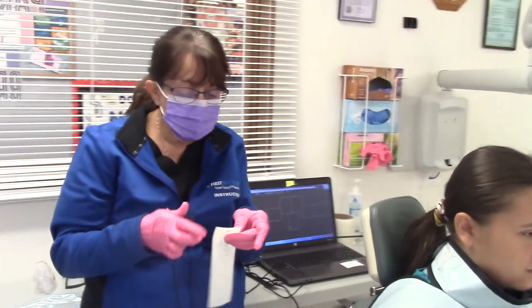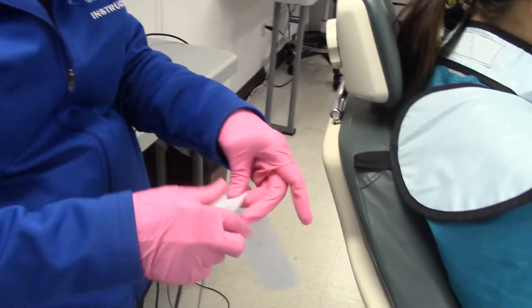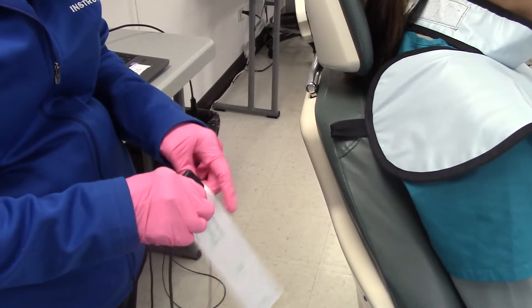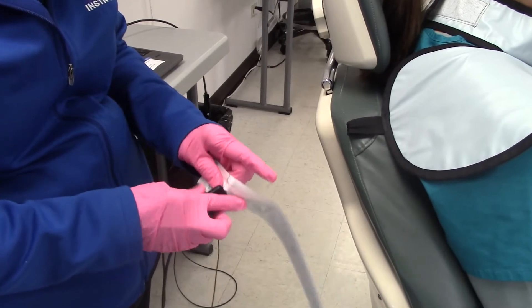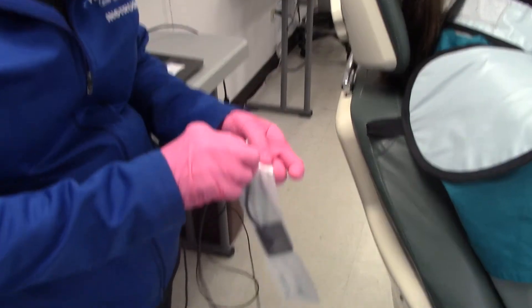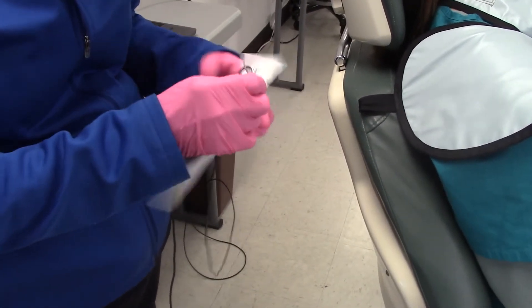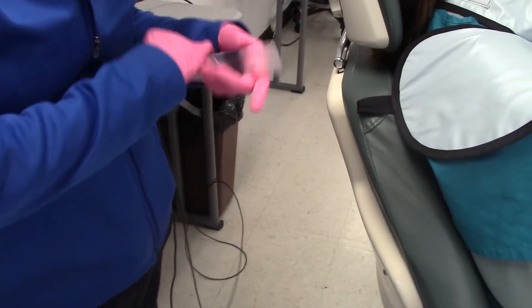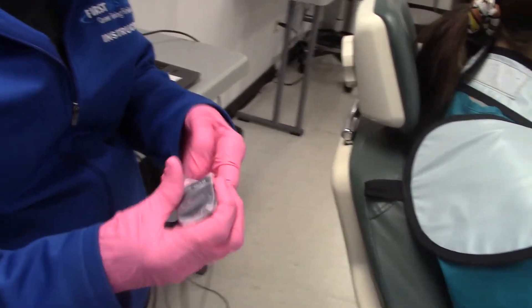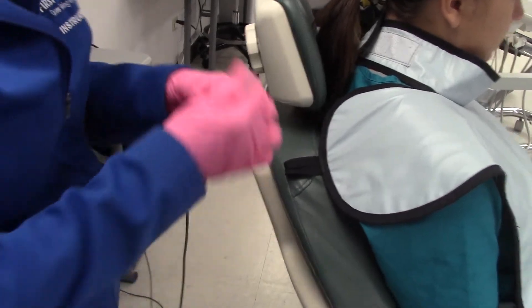We have our sheath that goes over the sensor — you can see there is a slit in it and the sensor will slide in there. You want to make sure that the sleeve is all the way down and wrinkle-free.